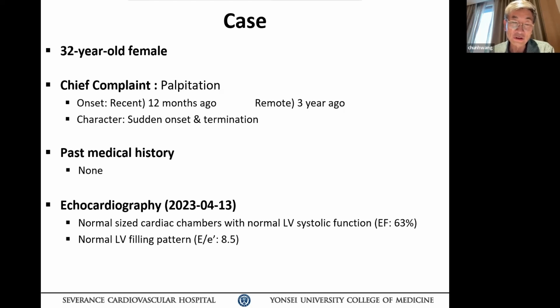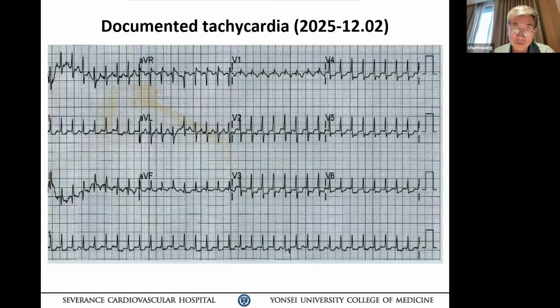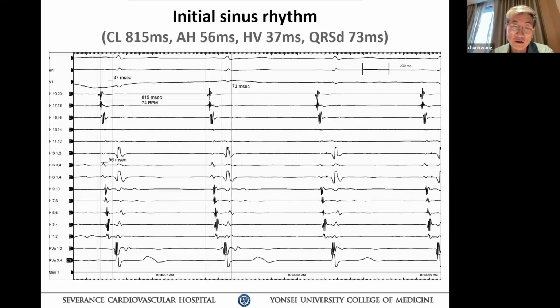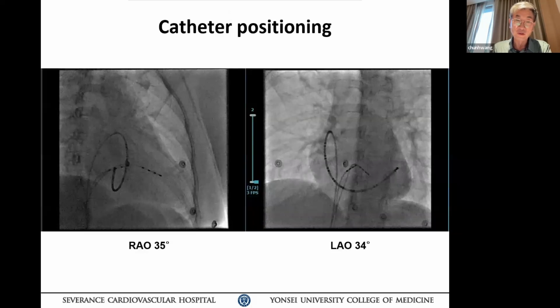All right, let's keep going down the other issues. This is normal. That's beautiful, you've done really well. Okay, look at the chest X-ray now. Go back to the chest X-ray, please. So this is a nice, not that heavy lady. What do you think about this heart? It's a very slender, pendulous heart, right? So this patient would be one that has a more vertical tricuspid annulus, and your coronary sinus is going to be at a little bit higher setting. Okay, let's go. What do you think about this catheter placement? Go back a slide. Are you happy with this catheter placement?